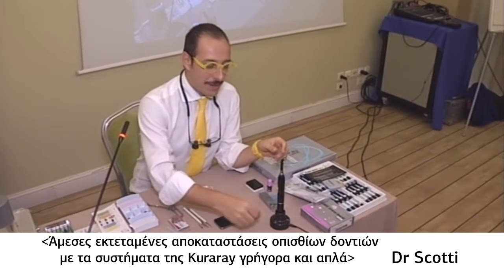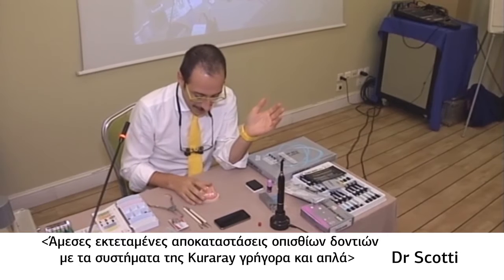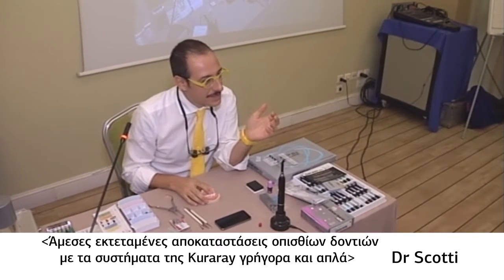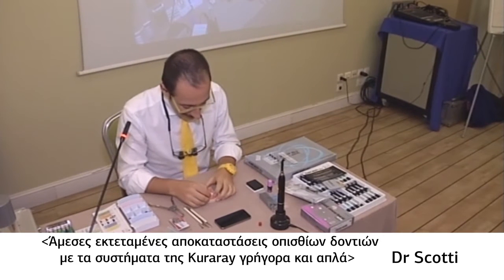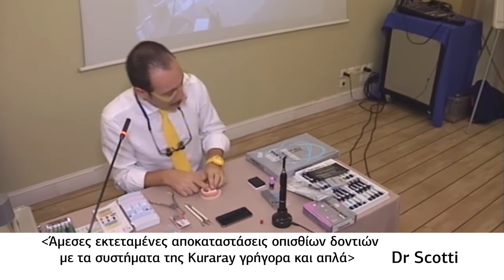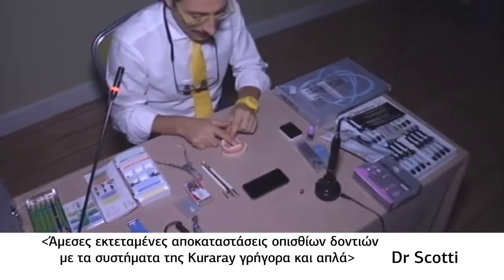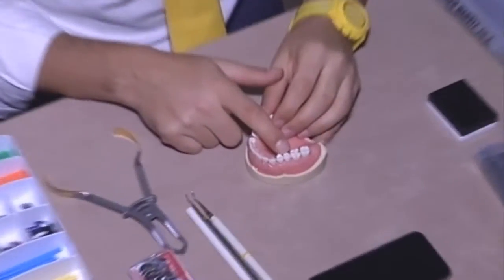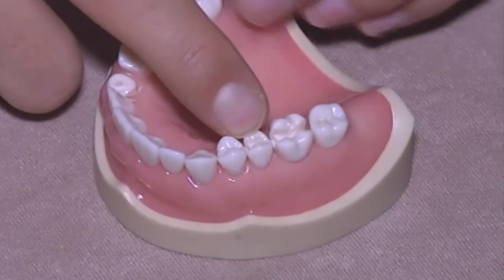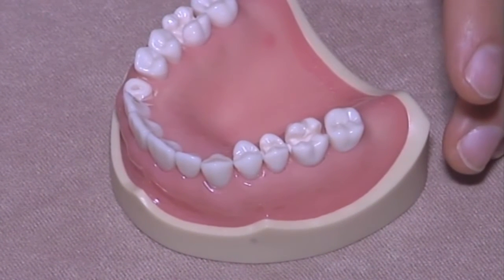Third part, today we are going to cover almost everything of direct restorations. We're going to perform 2 direct restorations on 2 posterior teeth. Here we have a model with MOD cavity on a first molar and occluso-mesial cavity on a second premolar. Okay, sorry.